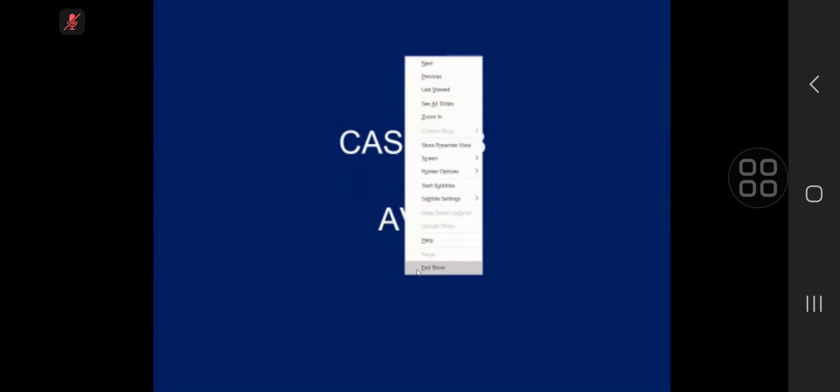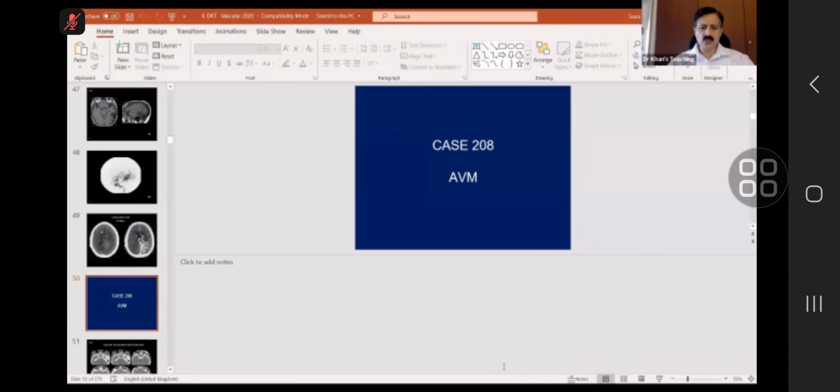Now, case 208 is the type of case of AVM which will come in your exam. So let me show it to you.